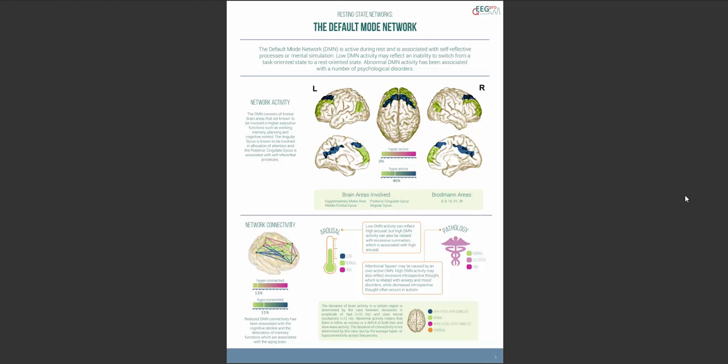The ratio between high and low frequency power is used here to determine whether a brain area is hyperactive or hypoactive or shows a mix of both hyperactivity and hypoactivity. For example, when there is both high power in high frequencies and high power in low frequencies. The horizontal bars show the percentage of brain activity that show hyperactivity and the percentage of brain areas that show hypoactivity.